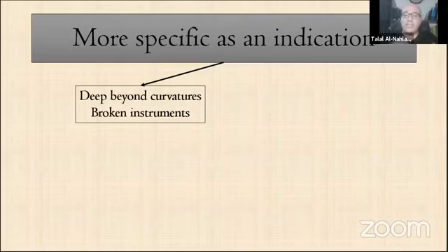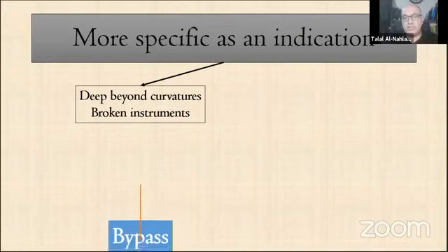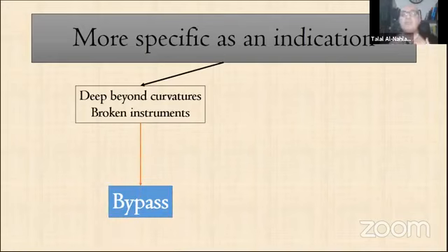We have to stick to what was mentioned by Dr. Hamo: if the file is deep beyond the curvature and we cannot see the broken file, it is not logical to try to remove it. Although some speakers and friends of mine, like my friend Yoshi Terauchi, love to do this, I don't dare to try to remove a broken file beyond the curvature, because I believe I will destroy more than I can make something good.